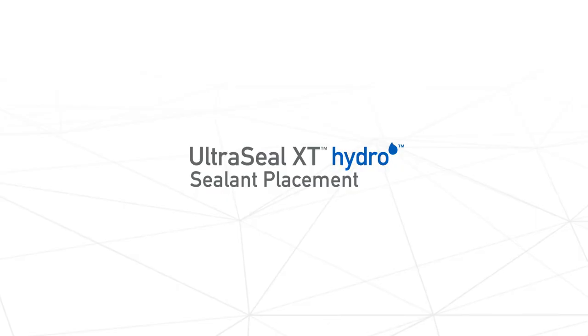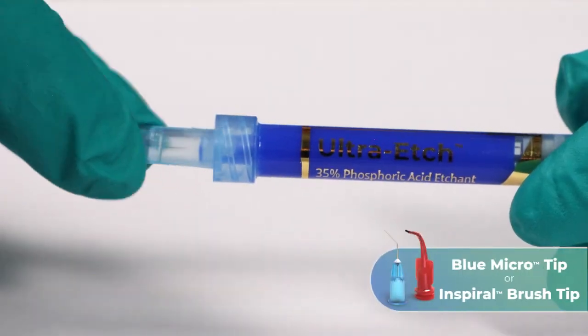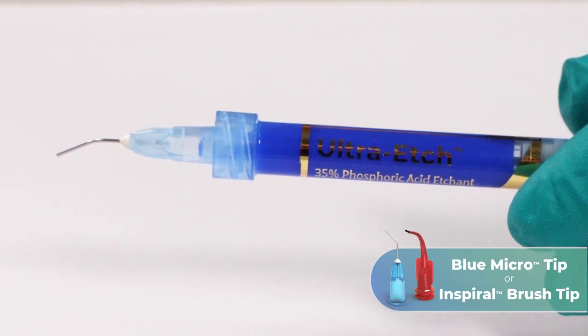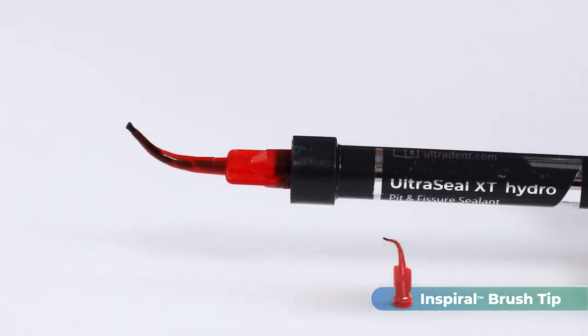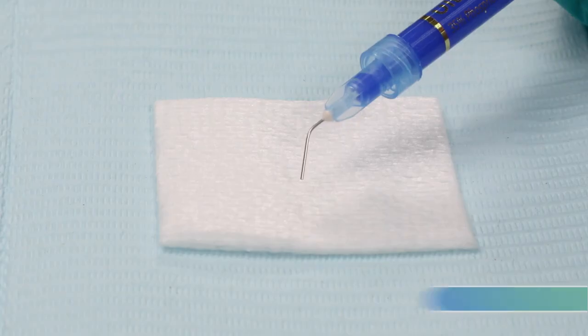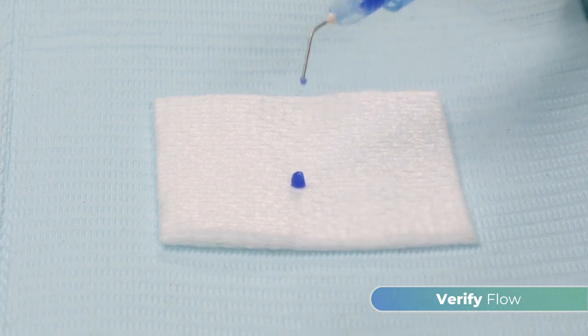To prepare UltraSeal XT Hydro Sealant for placement, attach an Inspiral brush tip or blue micro-tip to an Ultra-Etch 35% etchant syringe. Attach an Inspiral brush tip to an UltraSeal XT Hydro Sealant syringe. If needed, adjust the bristle length by grasping them and moving them in or out. Verify the flow of all syringes prior to using them intraorally.